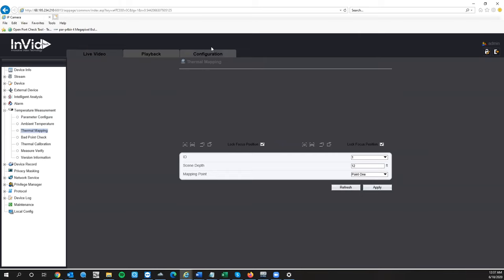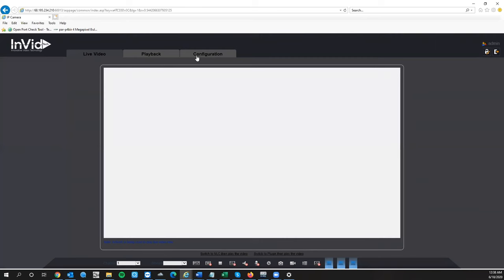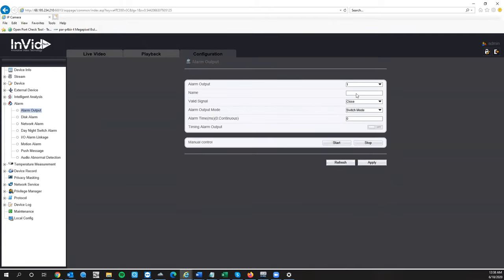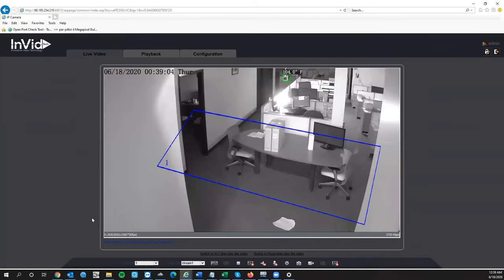Also, regarding your alarm output, you can name each output so there's no confusion — for example, name output one 'green light' and output two 'red light.' You can also set how many milliseconds you want the alarm to be active. For example, 5,000 milliseconds equals 5 seconds. If you leave it on Continuous, you'd have to log into the camera and click Stop to turn it off, so setting a specific time is highly recommended. That is the complete setup process for the SCC BodyTemp Cam 1. Thank you for your time.